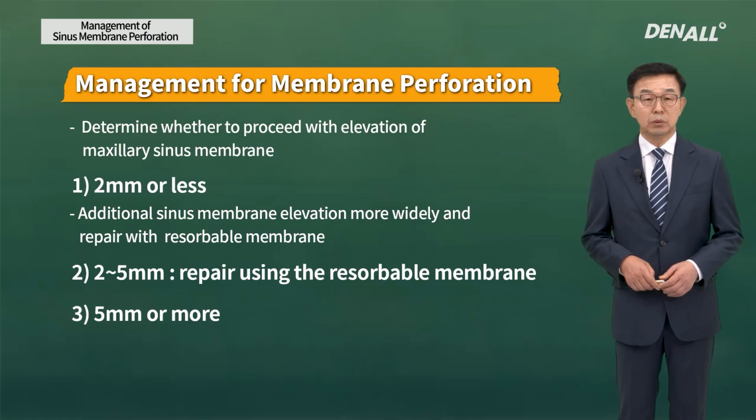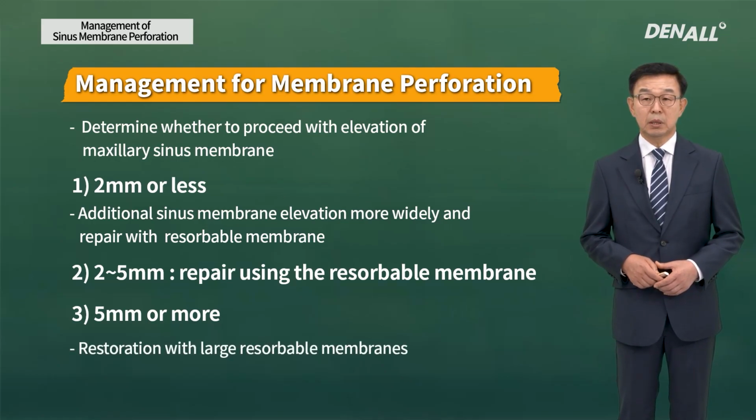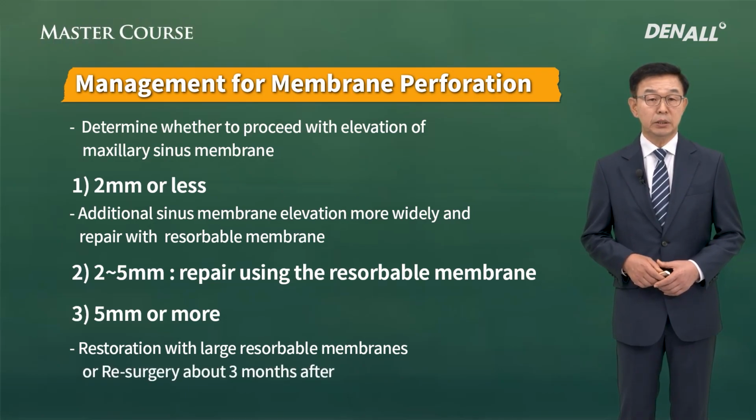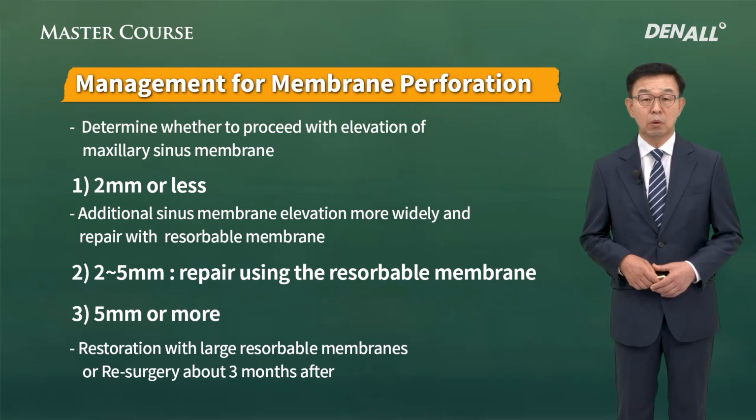If it is over 5 millimeter, if you have a lot of experience, you can use resorbable membrane and repair and proceed. However, if you're less confident, you close out and wait up to 3 months for the sinus membrane to heal completely before making the attempt once again.